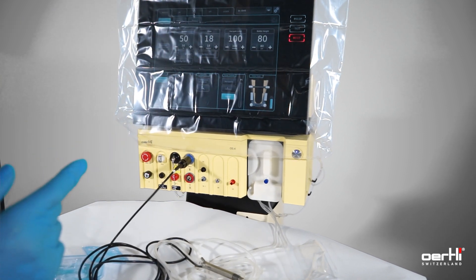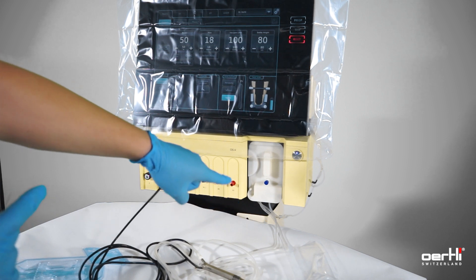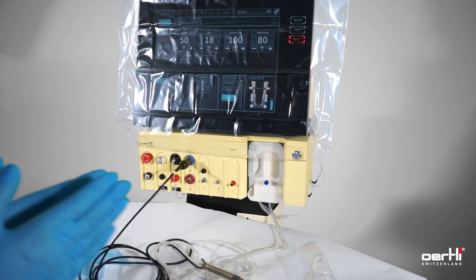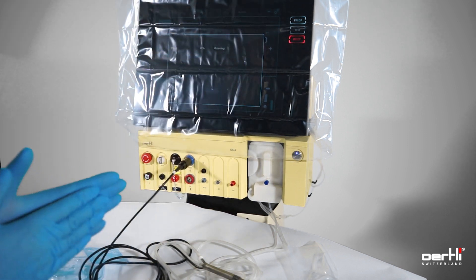Double check that the infusion line is open and connected correctly. If you feel ready, press pre-op to rinse the tubings.